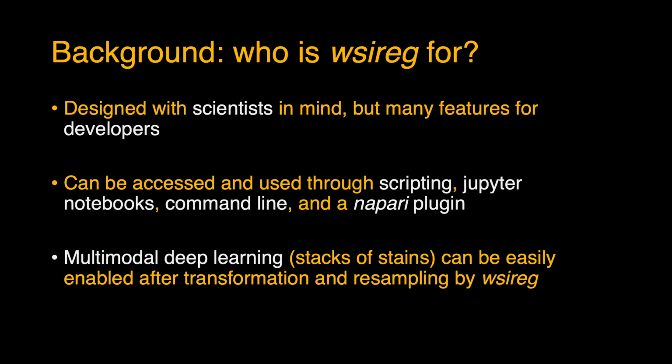I use it a lot from the command line, so there are some configuration files you can generate that will set up the graph, and as well, obviously, the Napari plugin. So it's kind of however you want to do it. There are lots of ways to access this software and make it useful for you. And I think the plugin has a lot of benefit because it really helps navigate some of the complexity possible in WSIReg, as well as making simple the sort of two-image registration tasks that may be what most people want to do.